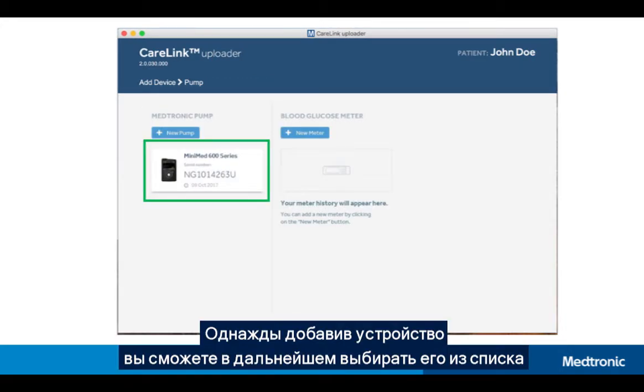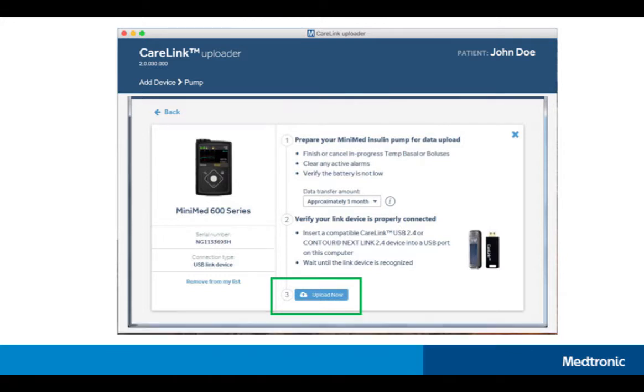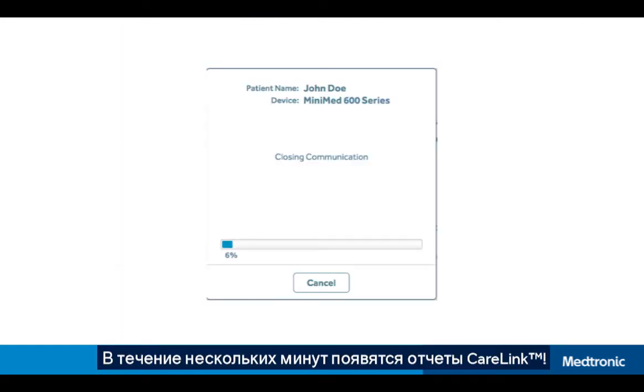Once you've added your device, you'll be able to quickly select that device from your list. After selecting the device that you want to upload, check to make sure your device is ready and click Upload Now to continue.